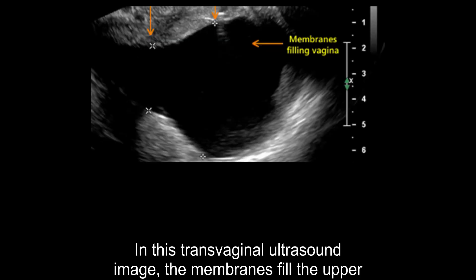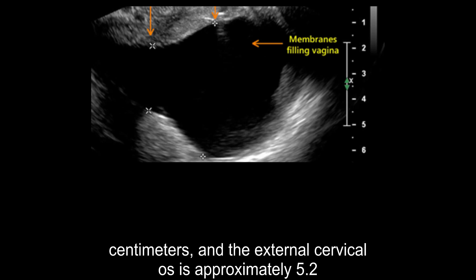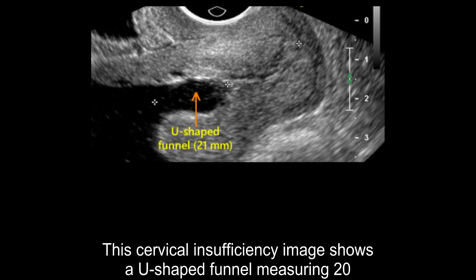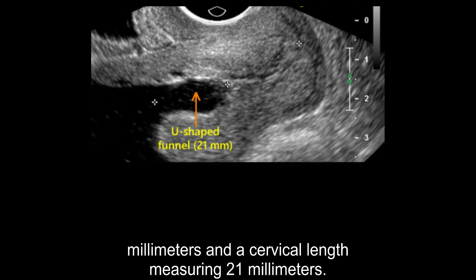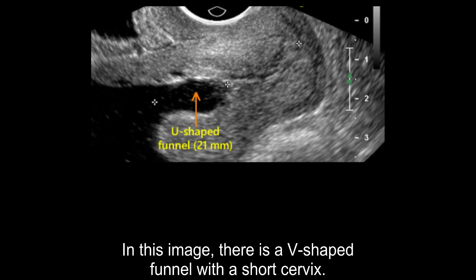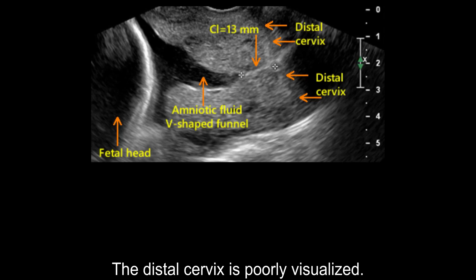In this transvaginal ultrasound image, the membranes fill the upper vagina. The internal cervical os dilation is approximately 2.5 cm, and the external cervical os dilation is approximately 5.2 cm. This cervical insufficiency image shows a U-shaped funnel measuring 20 mm and a cervical length measuring 21 mm. In another image, there is a V-shaped funnel with a short cervix, and the distal cervix is poorly visualized.